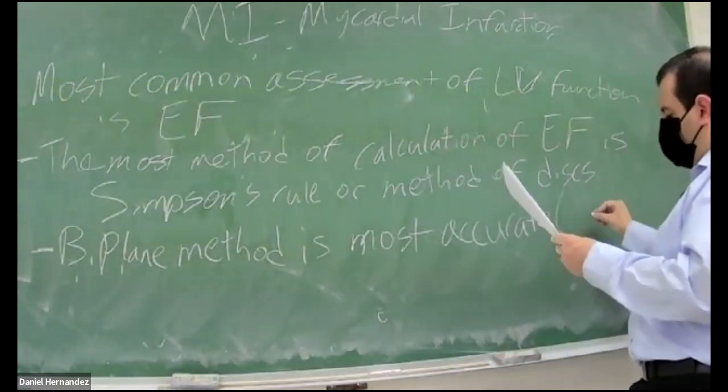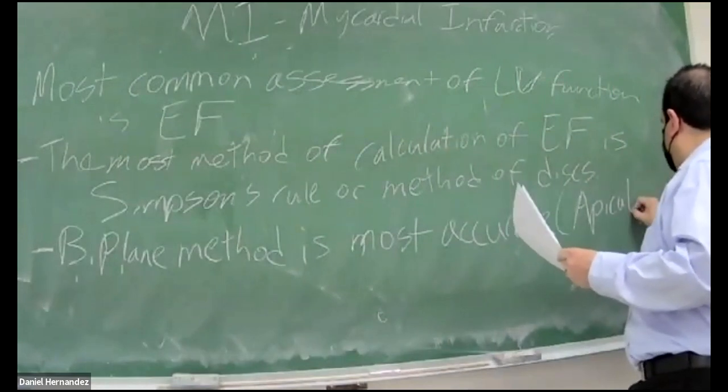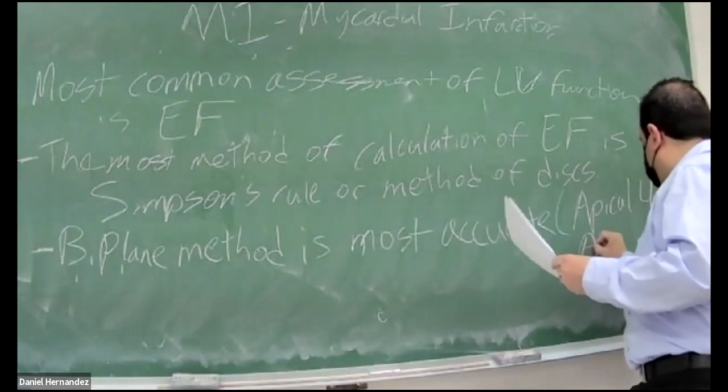For this, we do it in the apical 4 chamber and apical 2 chamber.